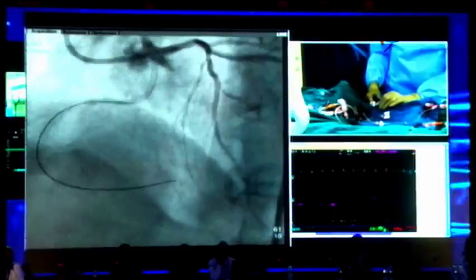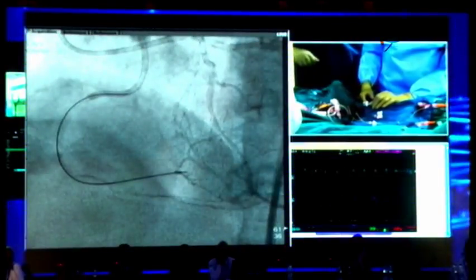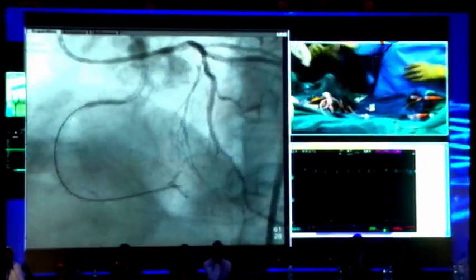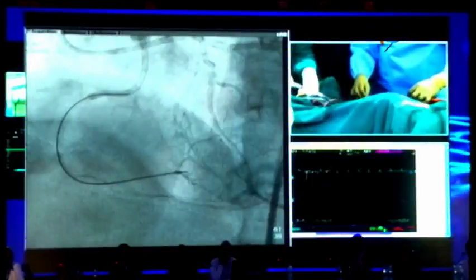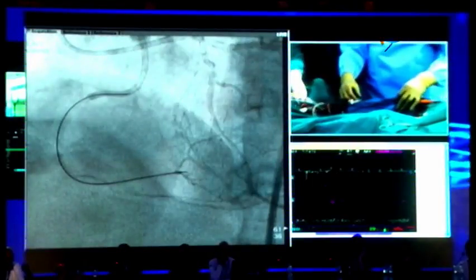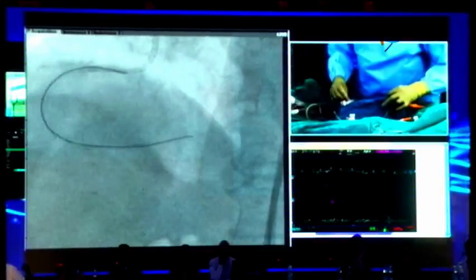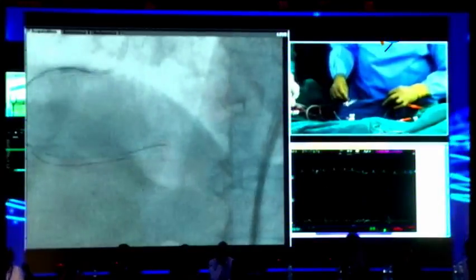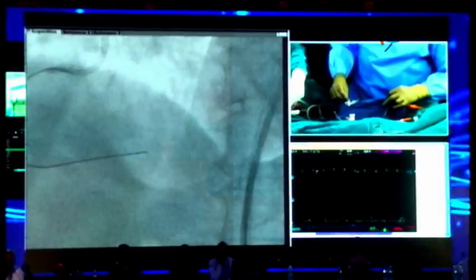So I want you to freeze it. No, we can't see the balloon. Okay, I want you to freeze it. Okay. A double mag would help. Freeze it and reference it. Yeah, in fact, I asked for double mag, so I don't know what's going on. Okay. Guys, can we go double mag briefly? Yeah, we can see it now. Okay, thank you. Okay, good.